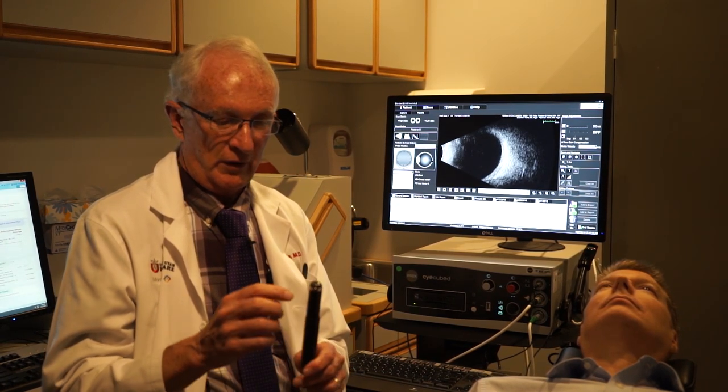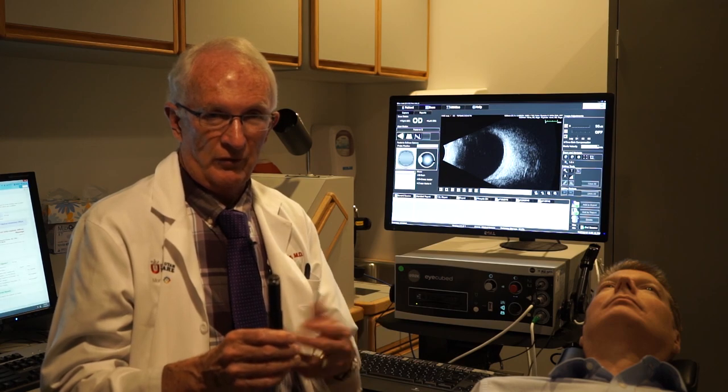I usually put a drop of anesthetic in the patient's eye and have the eye open during the procedure for better orientation and better sound penetration. We put a gel on the probe — in this case we use ones that are safe for the eye, such as artificial tear solutions or methylcellulose, which is what I'm using now — so totally safe for the eye.